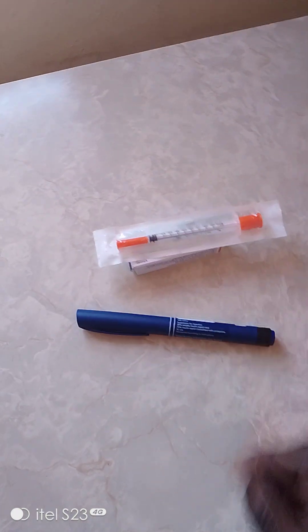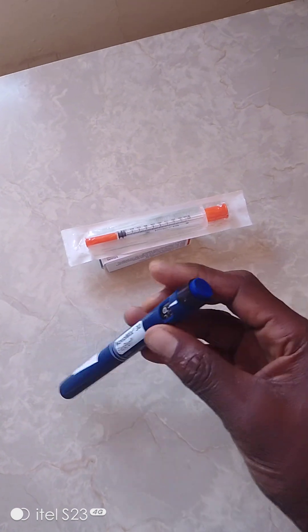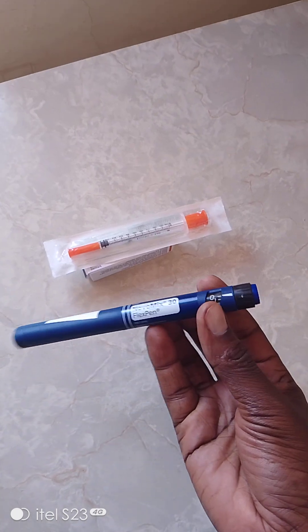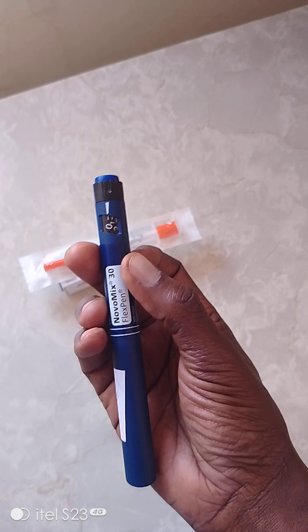For diabetes mellitus, this is very good technology. Let's try to use this advanced technology because it helps us to work well - you won't miss doses, it's not painful, and you can move with it easily as it has everything. Give IEC to patients and encourage them to use the flex pen. It may be expensive, but some facilities or NIMA may provide it for free. Thank you very much.